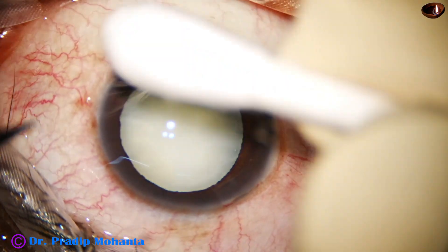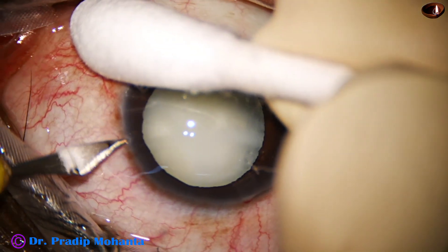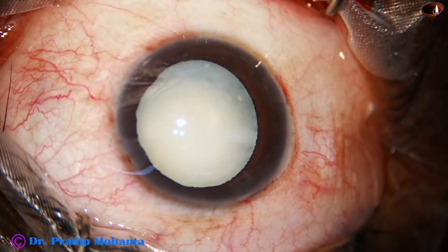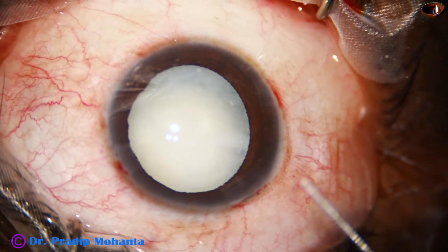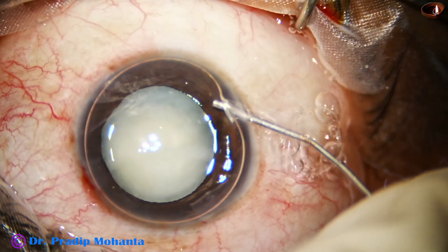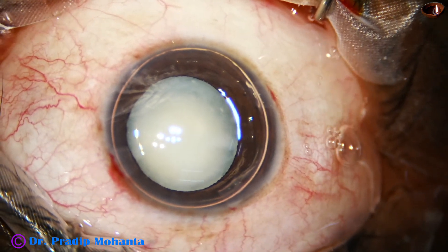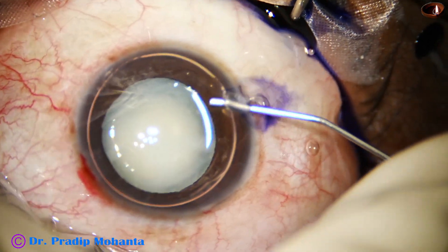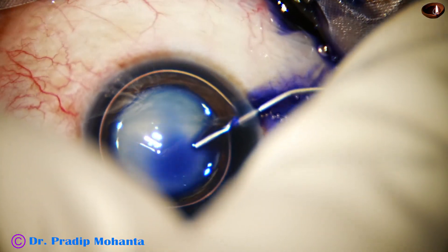This is a side port on the right side of the main incision, and this is another side port on the left side. The side ports are 3 clock hours away from the main incision. If the side ports are 90 degrees away from the main incision, astigmatism induced by the main incision is neutralized to some extent by the side ports.